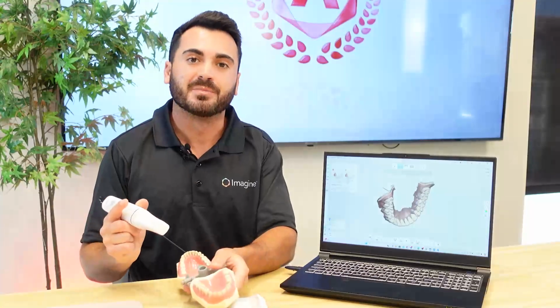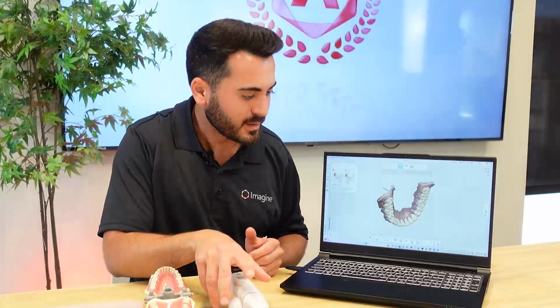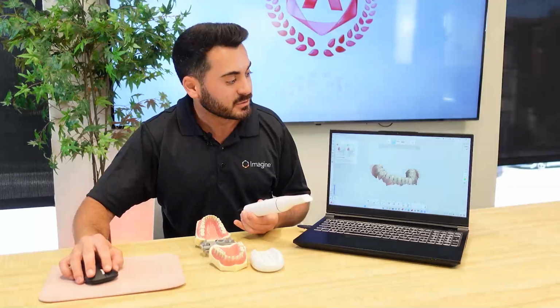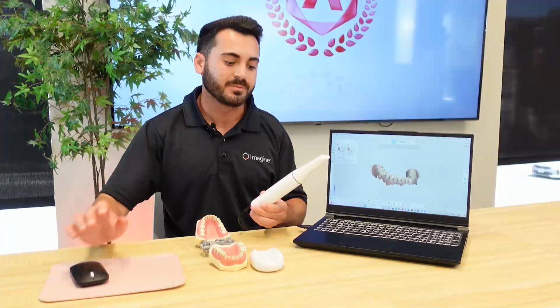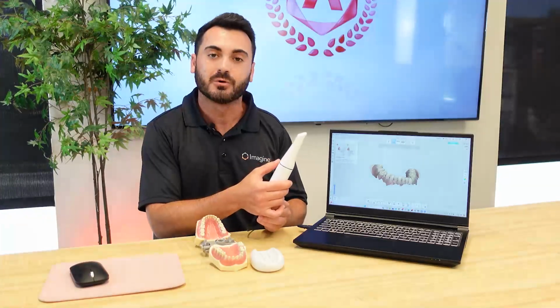Okay, now we have a complete scan and we're ready to move on to our next arch. In order to move on to the next stage, you can either use your mouse and click on our maxilla stage, or you can simply swipe right towards the direction of the stage that you want to move to on your touchpad.